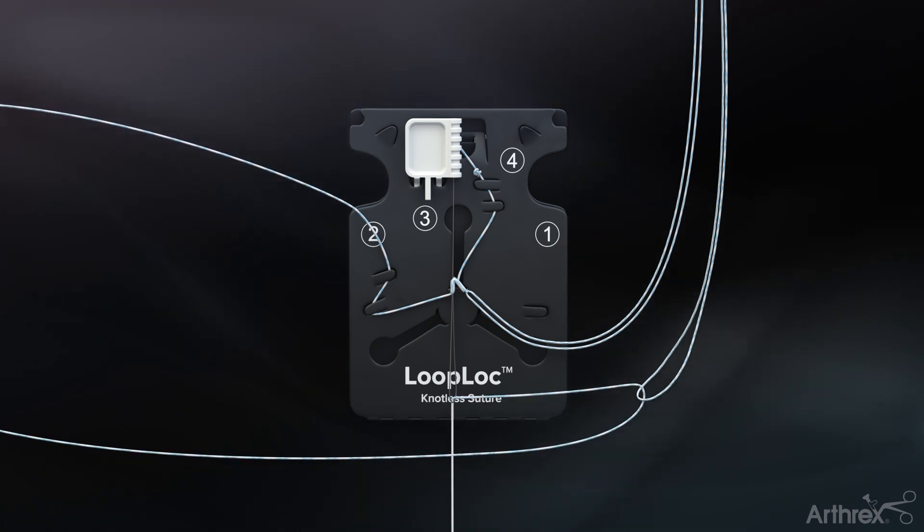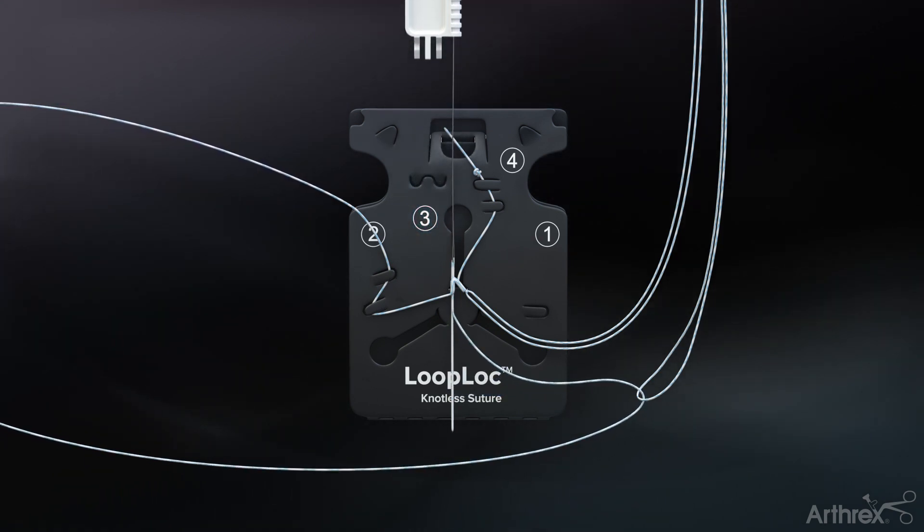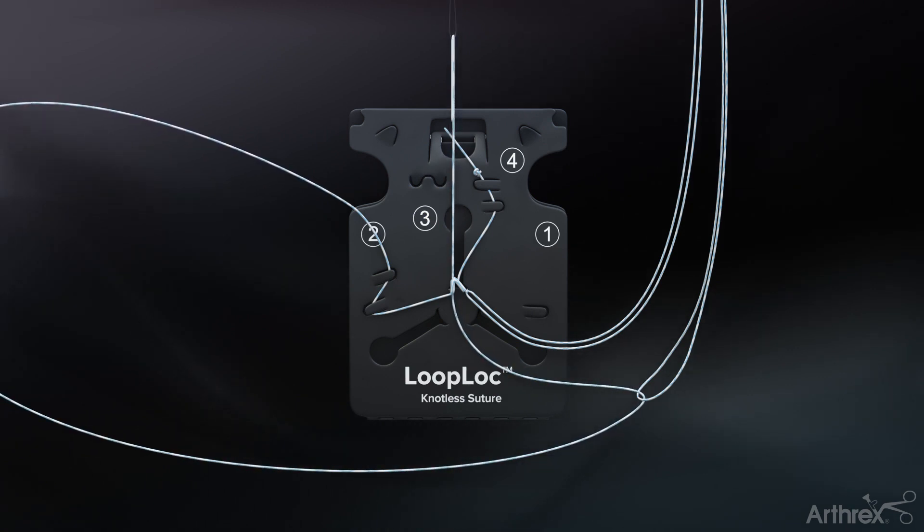Fold approximately five centimeters of suture over the suture threader and pull the suture threader tab labeled number three in an upward motion until the suture splice is complete.